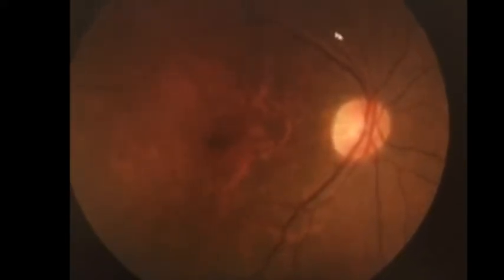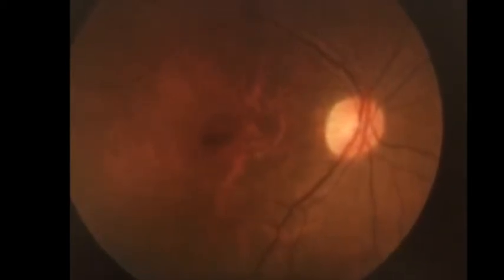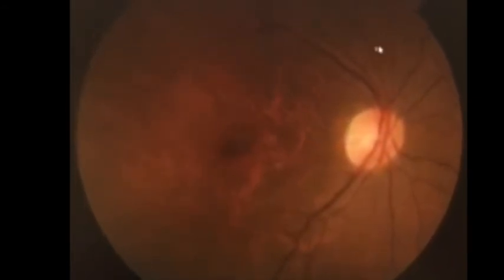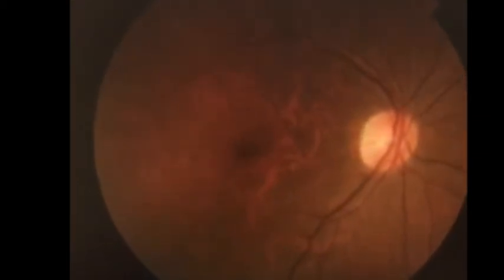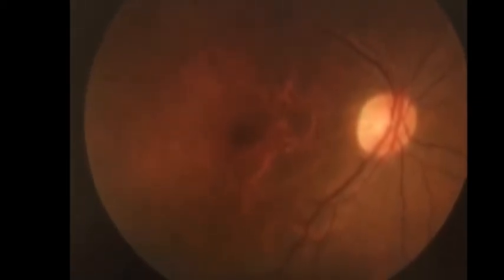Obviously you can see there's lots of blood vessels, so we have the arteries and the veins here which take the blood back and from the eye, and we can tell from the blood vessels if someone has high blood pressure or diabetes, high cholesterol, amongst other vascular conditions.